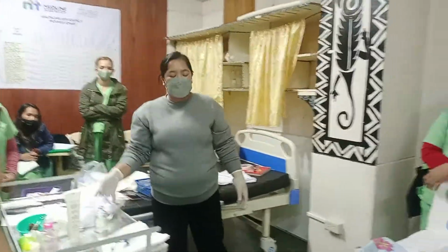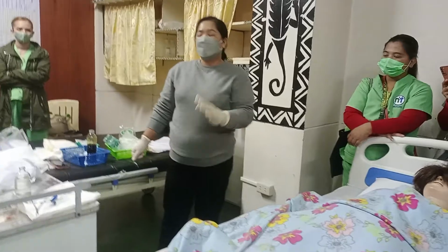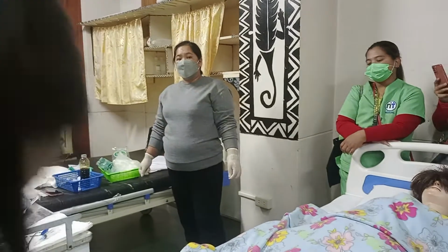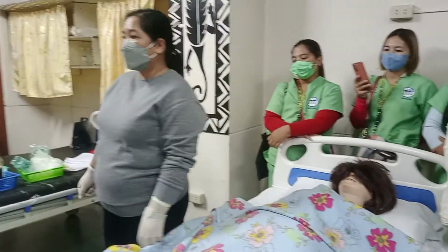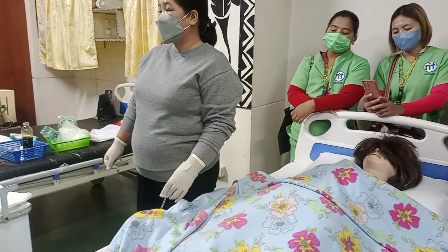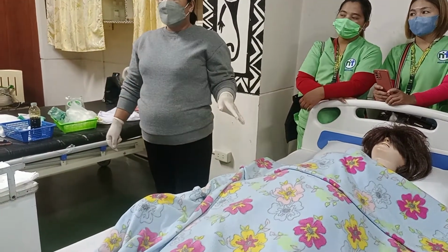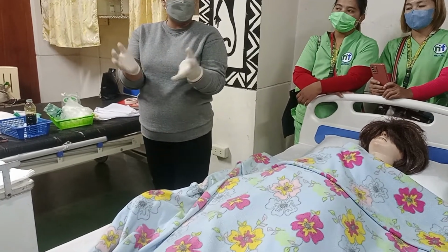Now, paano kung after 4 days, sinabi ni Doc, oh, pwede na daw tanggalin yung catheter ng patient ninyo. So, paano ninyo tatanggalin yung catheter ng patient ninyo? Okay? Pag sinabing pwede na, huwag kayong basta-bastang nagtatanggal ng catheter. You have to train the bladder. Ibig sabihin, ibalik muna ninyo yung sensation. Siyempre, in 4 days, wala yung sensation na naiihi siya. Kasi, freely flowing, hindi na napupuno yung kanyang urinary bladder.